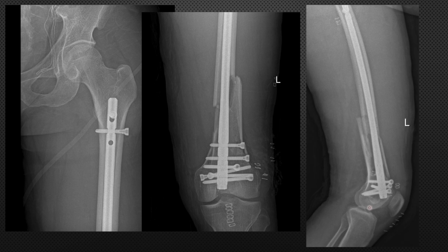The nail has sunk properly. And here you see in this x-ray, again this fragment has translated, but that's not an issue because ultimately the spike levels, the spike here and a cavity here, they are actually matching. That means the length is correct.